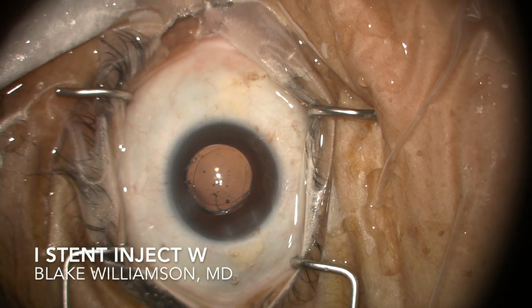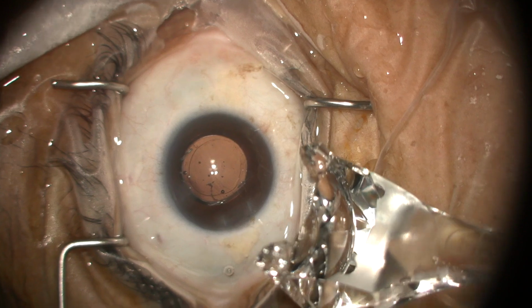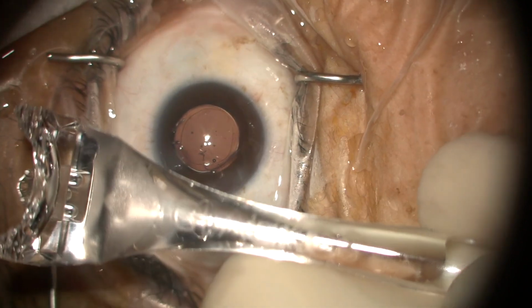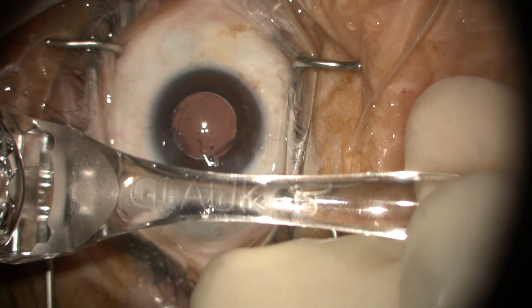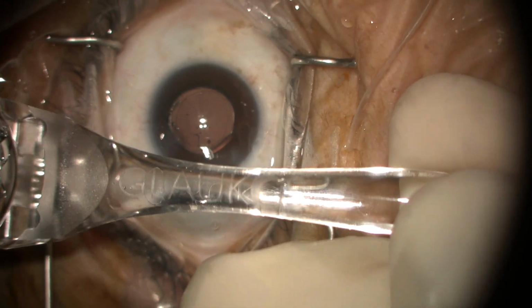Hey everyone, it's Dr. Blake Williamson from Williamson Eye in Baton Rouge, here to talk about the iStent Inject W, which is brand new. I'm going to show you an implantation and also talk about a few other things, including this new gonio prism from Glaukos.